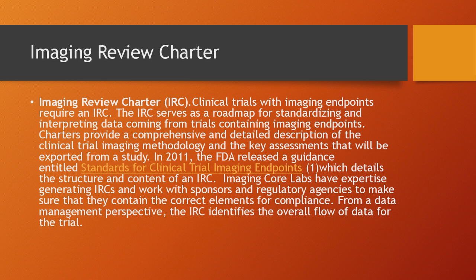Are they, for example, double read? Are we using two readers per imaging? How we relate the images to the clinical endpoints.